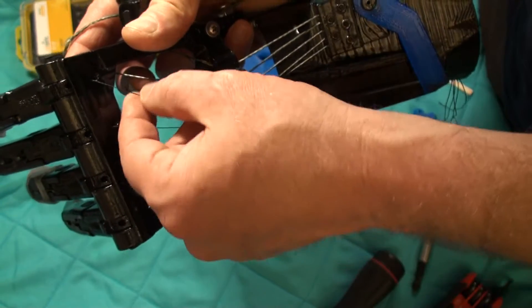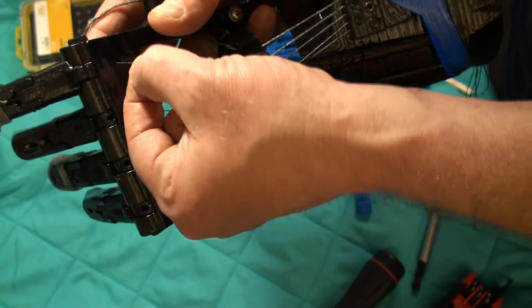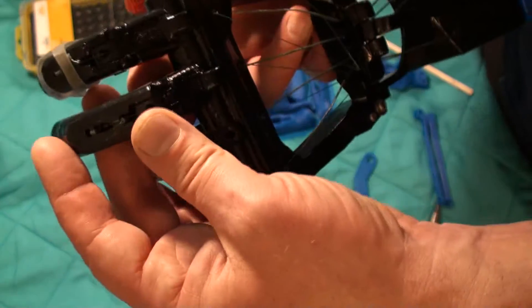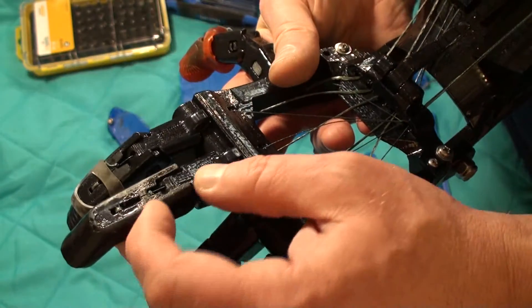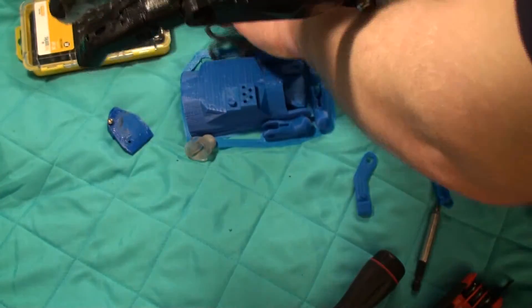This is 250 pound line and the extensors are 80 pound Dyneema braided fishing line. This is where the extensors terminate — you can see they're tied off right here on this bar. You can see the knot right there.